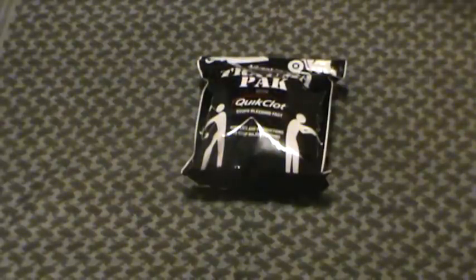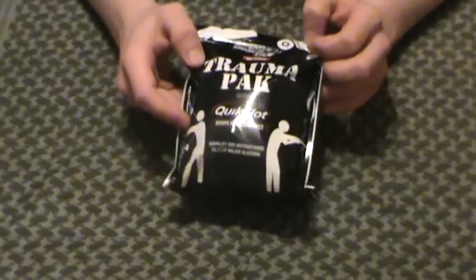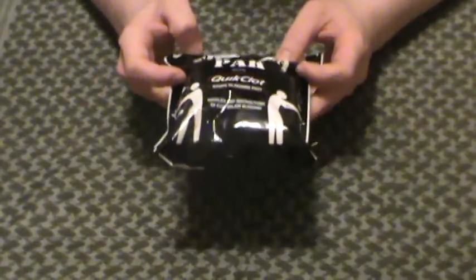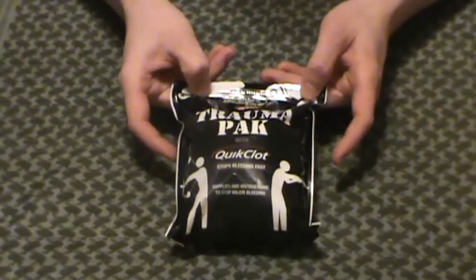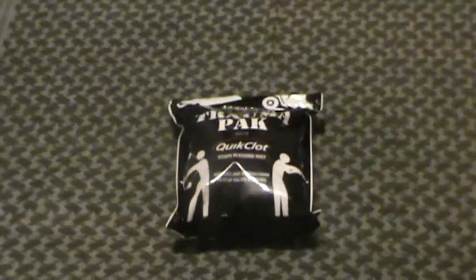Part 3 of my little packable field medical kit for basic camping and all that. This is going to be what I think is probably the most important part of the kit, other than maybe the Benadryl and the meds like I talked about on the last vid. This is the Quik Clot trauma pack. This one I've already opened just so I can show you easier. Normally it's sealed up nice and tight. It does have a little Ziploc top for use and reuse.